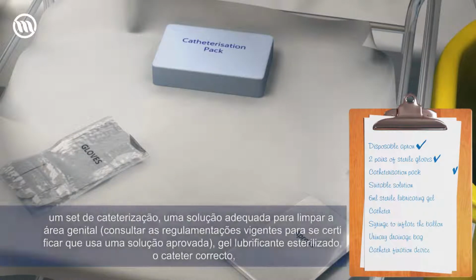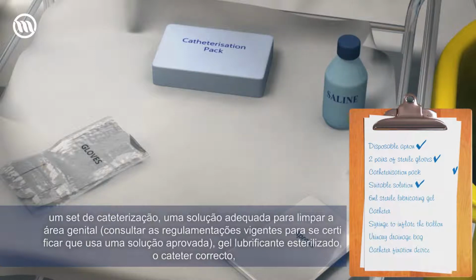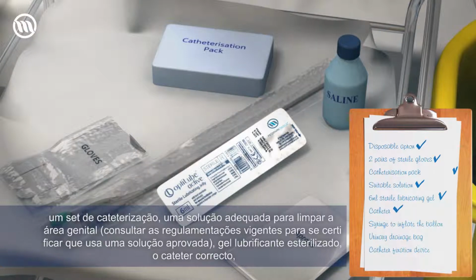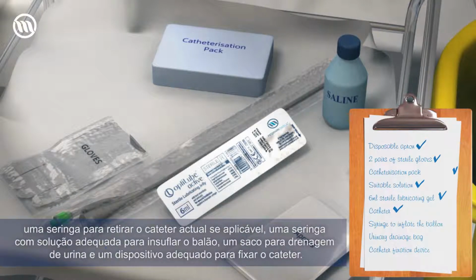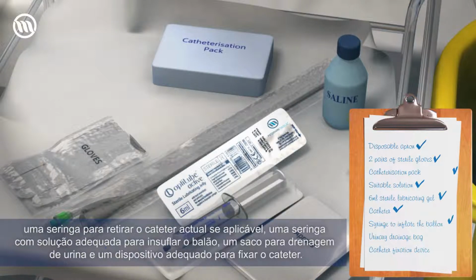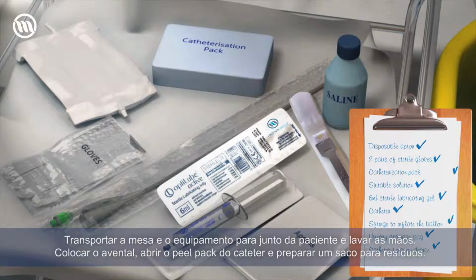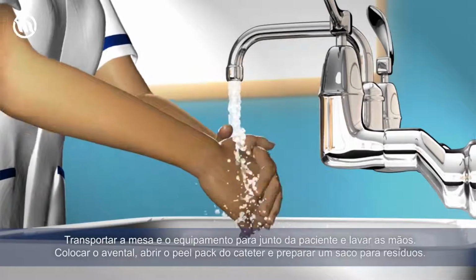A catheterization pack, a suitable solution to clean the genital area. Check your local policy to make sure you are using an approved solution. Sterile lubricating gel, the correct catheter, if applicable, a syringe to remove the existing catheter, a syringe with a suitable solution to inflate the balloon, a urinary drainage bag, and a suitable catheter fixation device. Take the trolley and equipment to the patient and wash your hands.